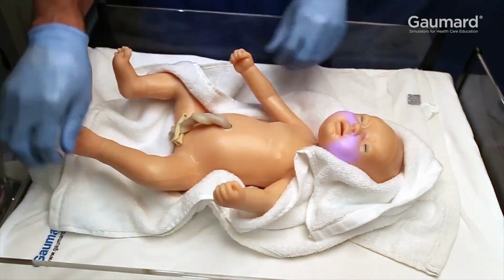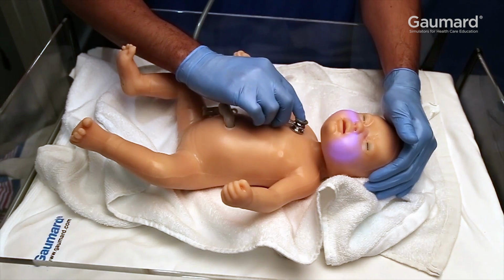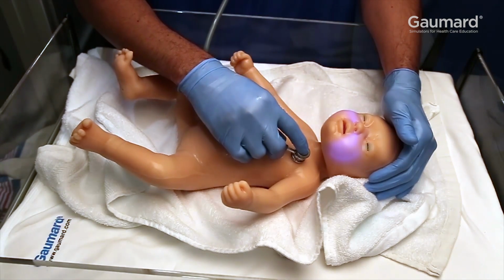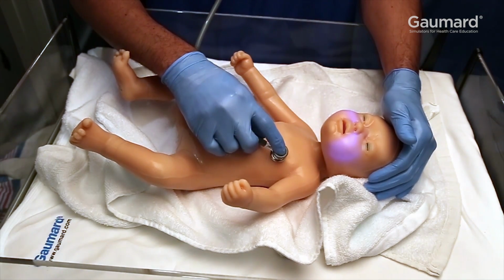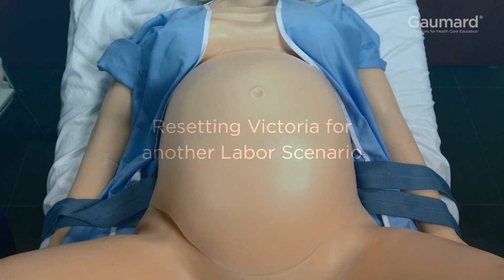The neonate can display cyanosis, crying, programmable heart and lung sounds, and realistic head movement. It will play whichever vitals were programmed during the labor for the duration designated by baby runtime. Once the scenario has ended, resetting for the next scenario is easy.